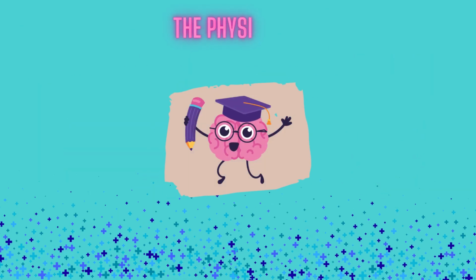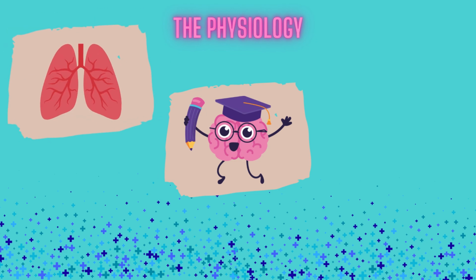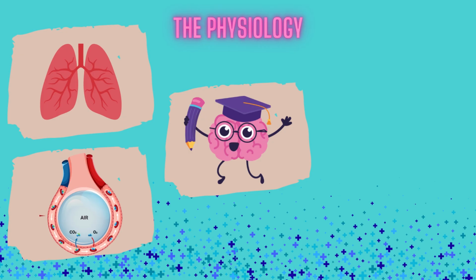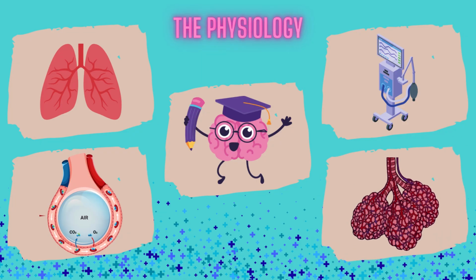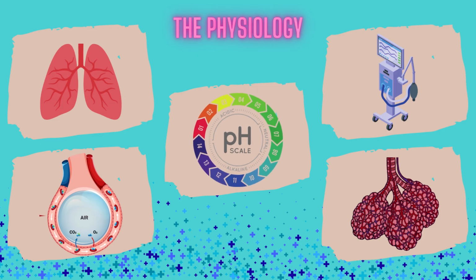To understand tube ventilation, we must revisit basic physiology. The lung's main role is gas exchange, oxygen in and carbon dioxide out. Mechanical ventilation ensures oxygen reaches alveoli, even when the patient's own muscles fail. At the same time, it helps regulate acid-base balance by controlling CO2 levels. This is crucial in conditions like respiratory acidosis, where ventilation buys time for treatment to take effect.